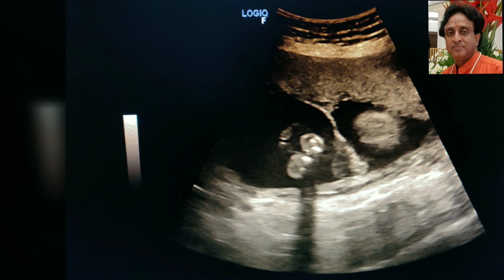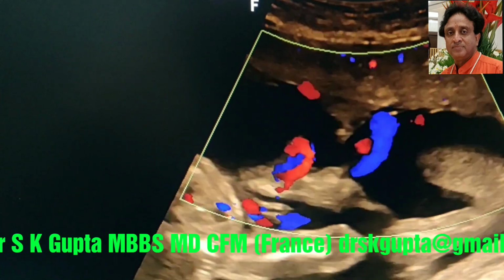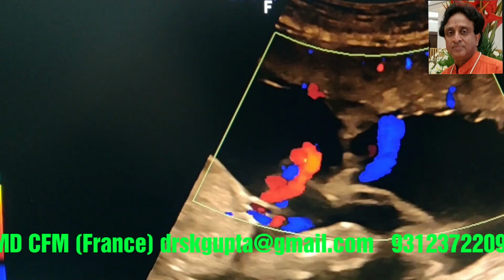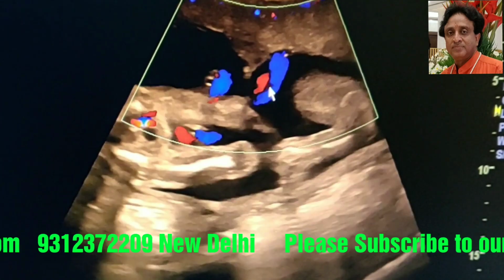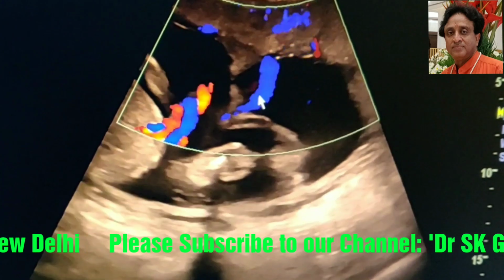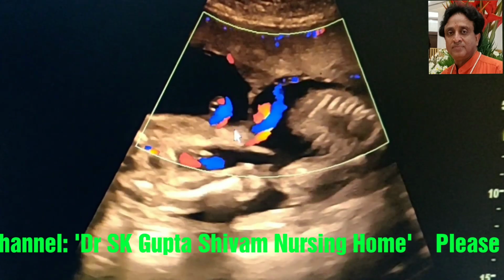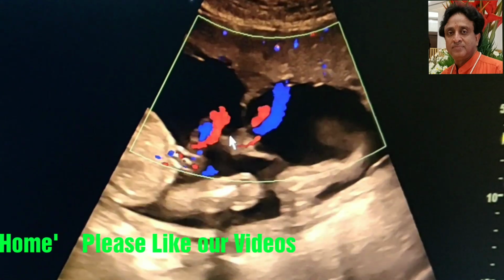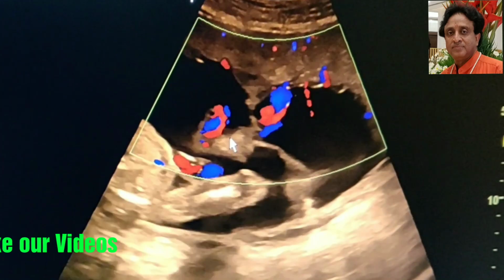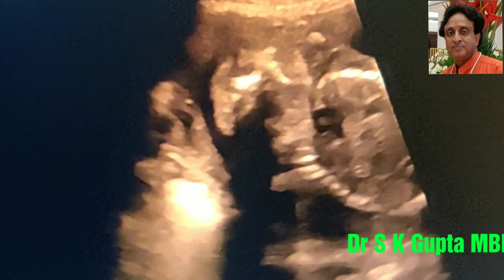But at a gestation of 16 to 20 weeks, this sign may not be able to differentiate between monochorionic or dichorionic pregnancies. In case of dichorionic twins, both the umbilical cords are likely to be attached at the center of respective placentae. Here both the umbilical cords are attached at the center of a large placental mass, making it a monochorionic pregnancy. This is the fetus.